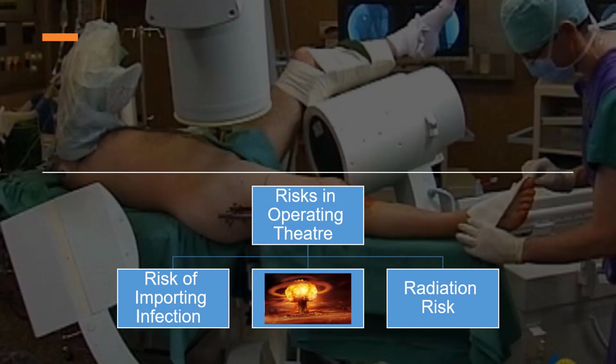What? Explosion? Yes, when you're using anesthesia, you have explosive gases that settle because they're heavier on the floor. When you plug your equipment in, you'll notice that the plugs are at waist level or higher, so they're above the gases so you don't get a spark and create an explosion. If the plugs were down on the floor and the anesthesia was going and there were gases down there and you plug in the equipment and it caused a spark, you could actually get an explosion. So sometimes there's some weird stuff there that you don't even think about, but can be really a risky type of thing.